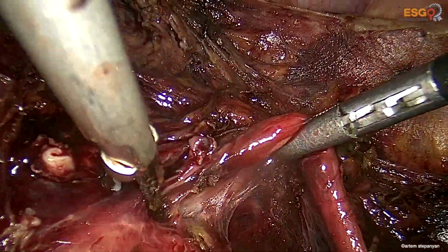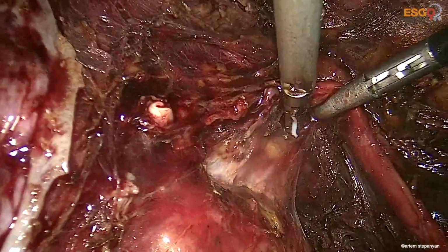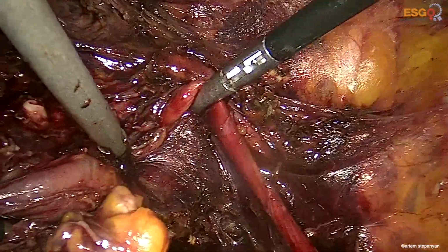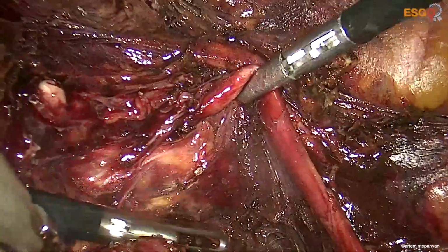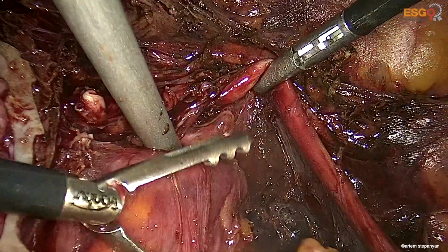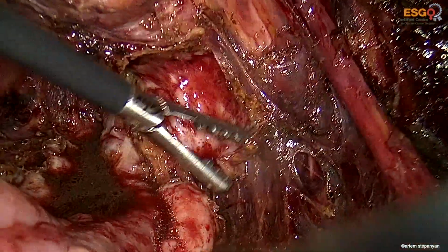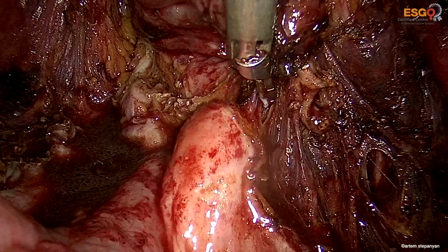Then we proceed towards the bladder. We see the ureter well, and we see how sticky the peritoneum is in this anatomical area. However, the goal is to keep the integrity of the tumor and to remove the whole disease in one block.